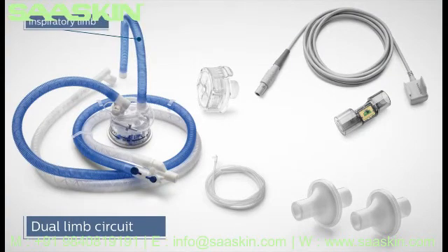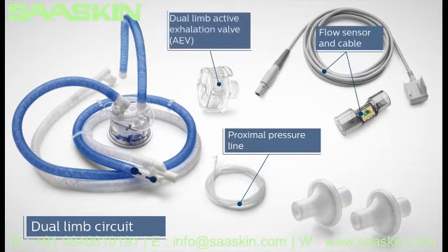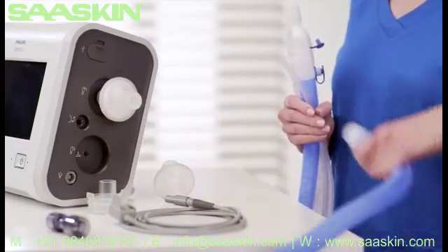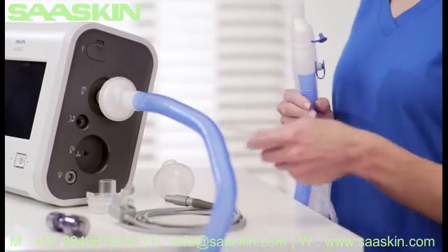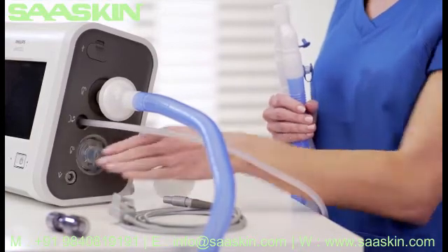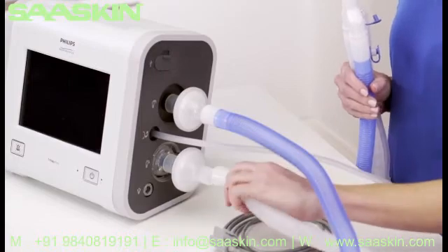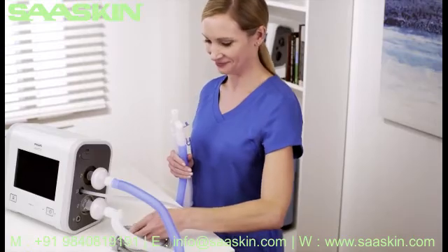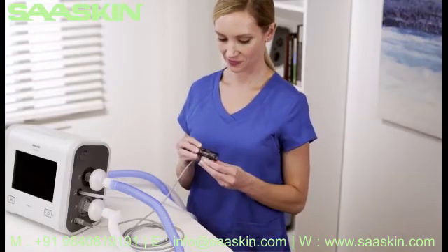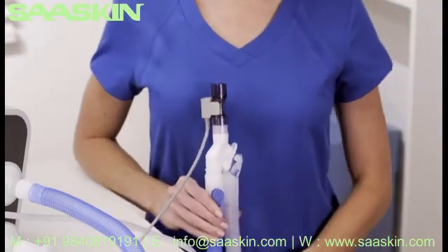The dual limb circuit has a blue inspiratory limb, a clear or white expiratory limb, two bacterial filters, a proximal pressure line, flow sensor with cable, and dual limb active exhalation valve, referred to as the AEV. Connect the bacterial filter and blue-colored limb to the inspiratory port. Then attach the proximal pressure line to the proximal pressure port. Now insert the dual limb AEV into the exhalation valve connection until both sides click into place. Then attach the bacterial filter end of the clear or white limb into the AEV. Attach the flow sensor cable into the connector, then attach the appropriate flow sensor. The dual limb circuit is now complete.